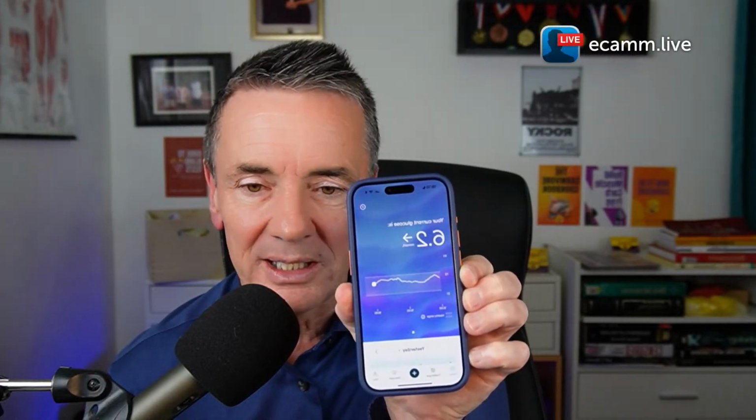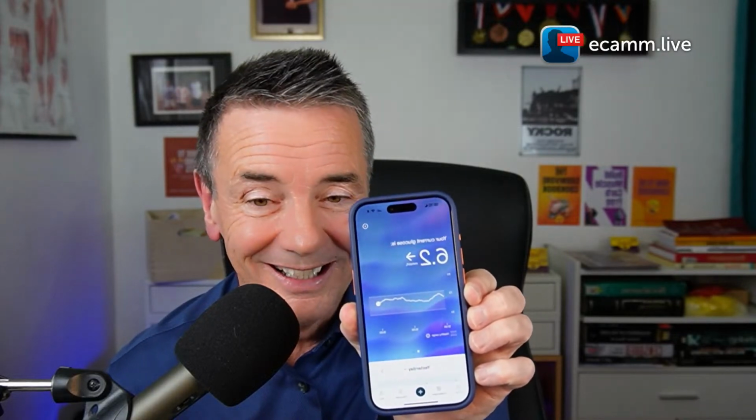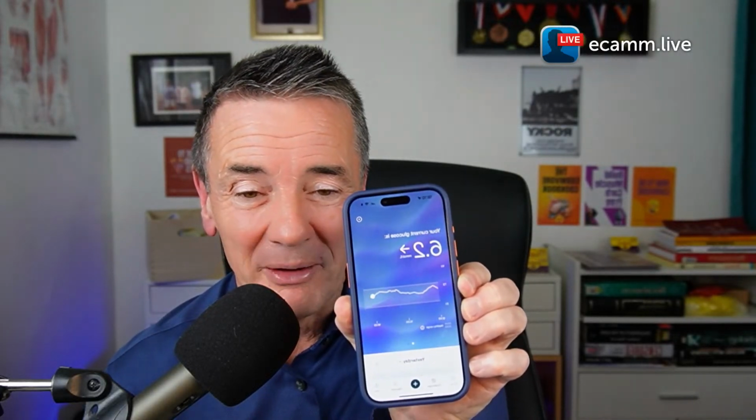It hasn't spiked up, even though I had a lot of fillet steak about an hour ago, maybe an hour and a half ago. So, yeah, the food has not taken me out, but it's generally higher because I've had a day full of stress, not sleeping, and all that sort of stuff. Right, so that's cool.